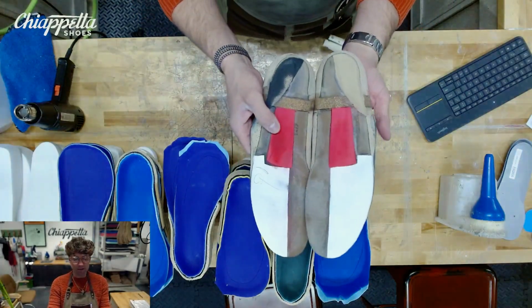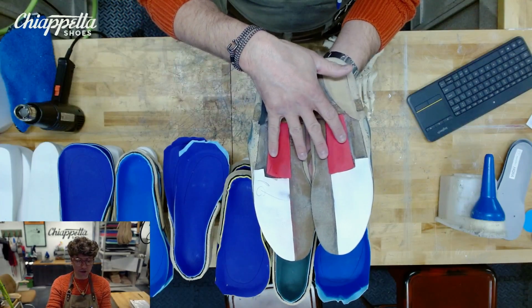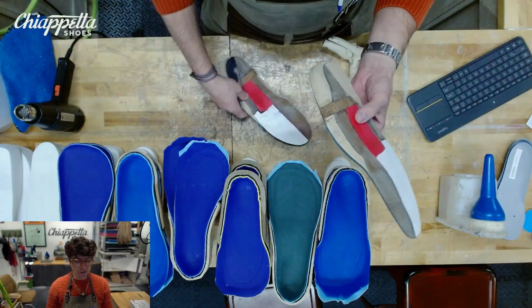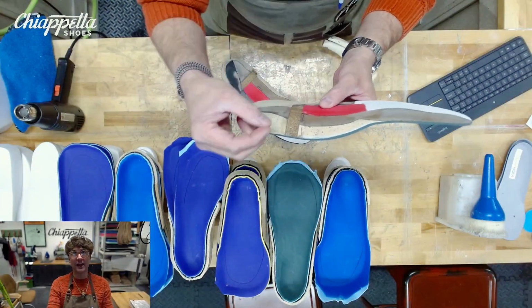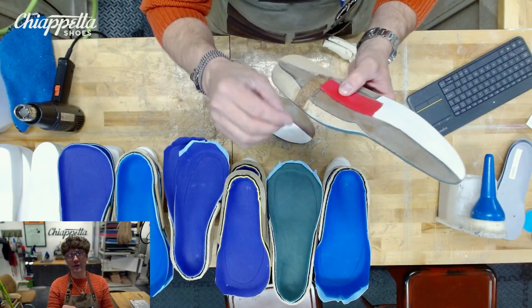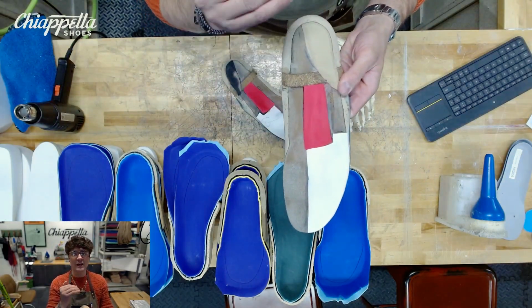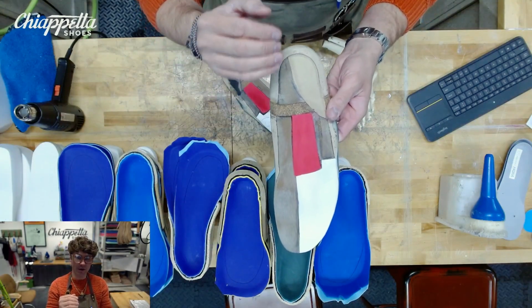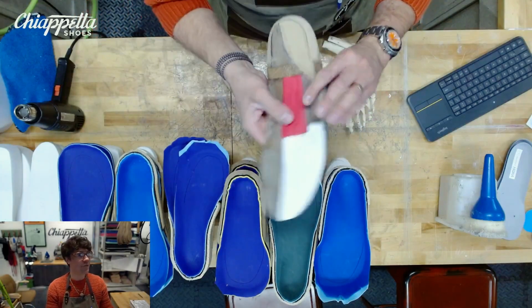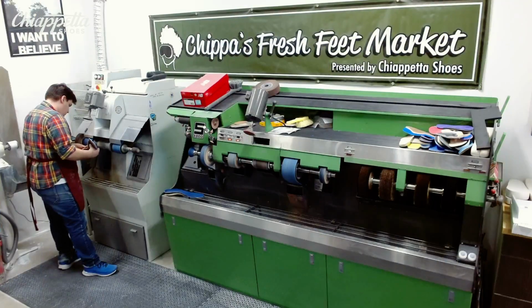So we're gonna do a few things today. We're gonna go back to neutral. We're gonna take off these longitudinal arch bars, the calcaneal bar, and the heel wedge. I'm actually going to scoop out the scaphoid area, or the medial arch. We're gonna replace that with 45 durometer EVA, and then we're gonna put just a 6 mil, or quarter inch, heel cushion. We're gonna elevate it just a touch. So we're gonna start off by going over to the grinder, and meet me over there in 2 seconds. There's Pete.